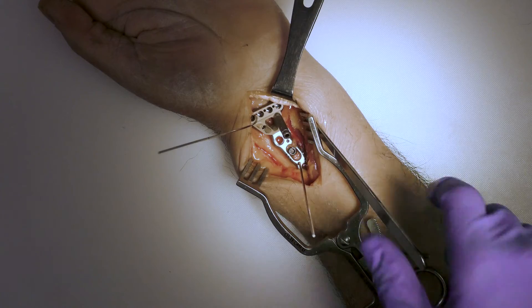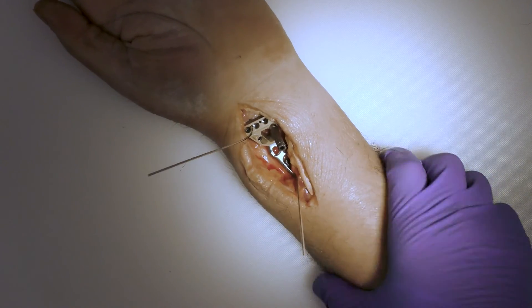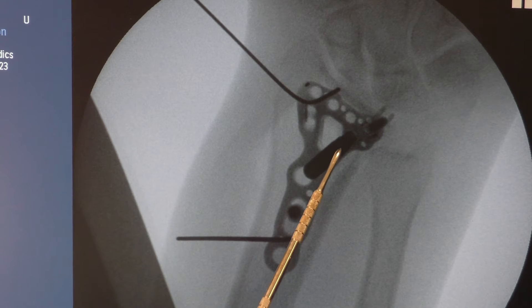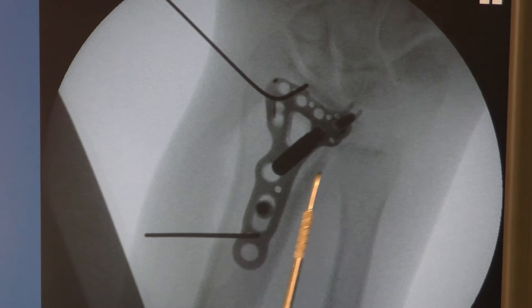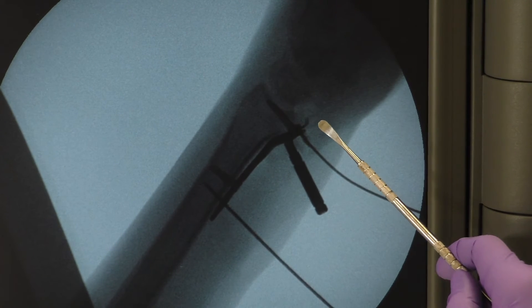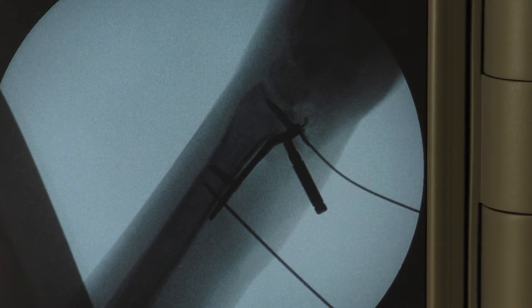For this demonstration we'll use the variable angle screw, utilizing your orange torque limiting screwdriver until you hear an audible click. From here, take additional x-rays to make sure the screw is of adequate length and the position of your hook plate has not changed. Here you can see good placement of the distal radius plate, the tines of the avulsion hook plate on the volar corner of the distal radius, and the plate is outside of the DRUJ. On your lateral x-ray you can see adequate positioning of the volar distal radius plate and the two tines securing that volar ulnar corner fragment.